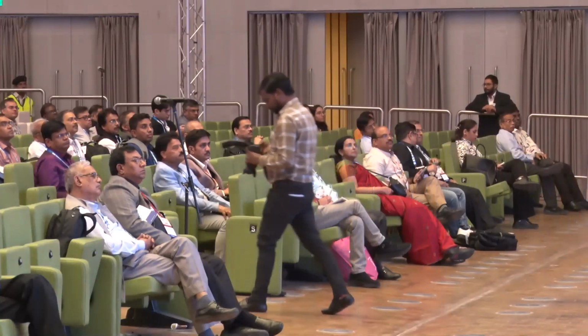Okay. I know you have done a study with the Hill RBF. Yeah, that was Hill. Even Hill RBF for me works extremely well, and I continue to use it. In fact, my printouts on the Lenstar are for the Hill RBF and the Barrett, and on the 700 they are usually for the Barrett alone. And on the Anterion, of course, we do ray tracing only for post-refractive surgery eyes basically.